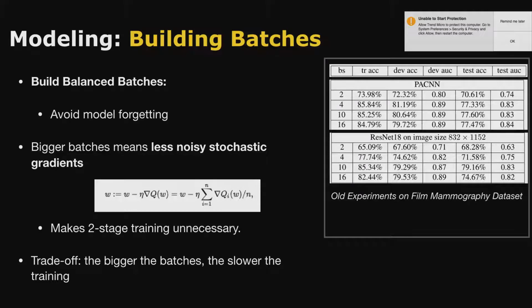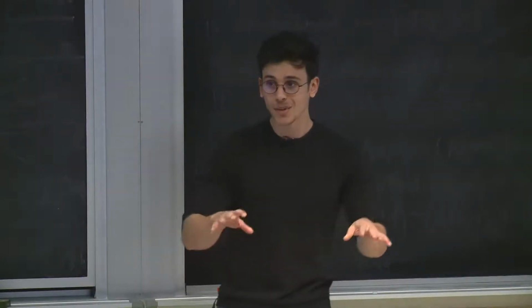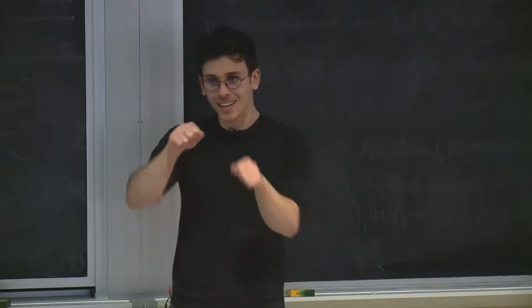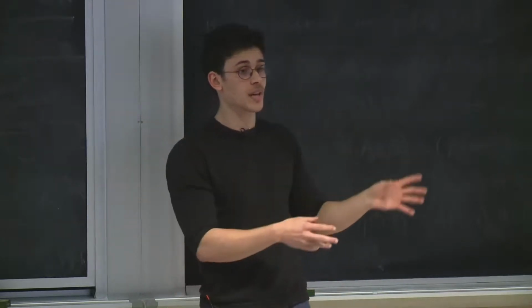This comes down to the fact that a batch size of 1 is particularly unstable. Another detail is that we always sample balanced batches, because otherwise you'd be sampling like 20 batches before you see a single positive sample, and you just don't learn anything. So if you do that, you don't have to do anything complicated. You don't have to do any fancy cropping or deal with region annotations. And we found that actually using region annotation for this task is not helpful.